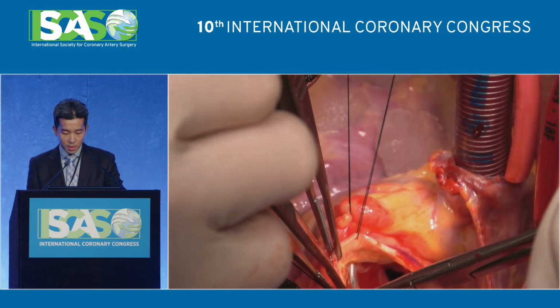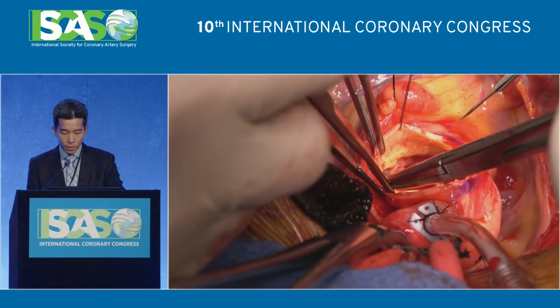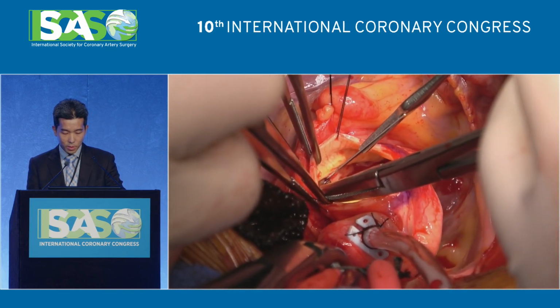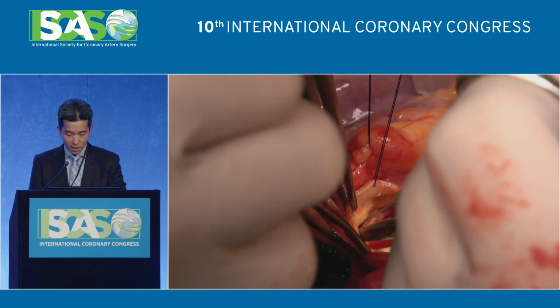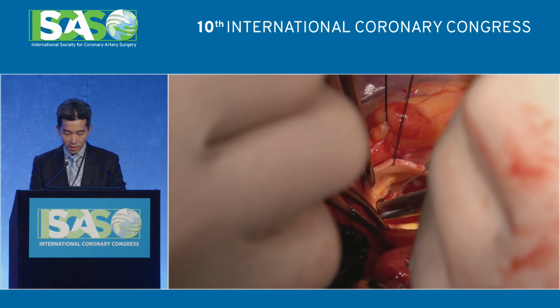Sometimes this tissue can be pretty thick and difficult to cut through. So we use a baby right angle to make some space and make our incision. And we try to do this pretty slowly. This is edited video, but this took us a lot longer than this looks. And part of it is because we really don't want to cut through to the other side.